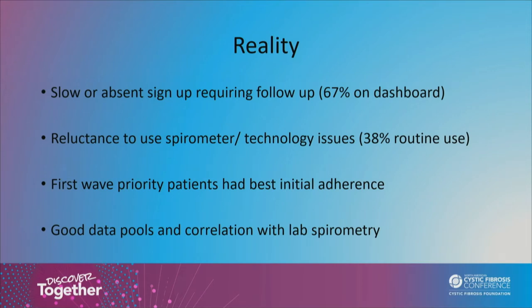And some patients had technology issues. Some patients are not very tech-minded. I'm sure they're really good at TikTok, but they're not really good at downloading spirometry apps. And then dealing with a pediatric center, you have the question of, should that app be on a 12-year-old's phone and not the adult's phone? And if it's on the adult phone, are they the primary caregiver? Are they going to be able to coordinate? Is mom going to be able to get the kid out of their room to do spirometry once a month? So those are issues I think are important, especially in pediatrics.